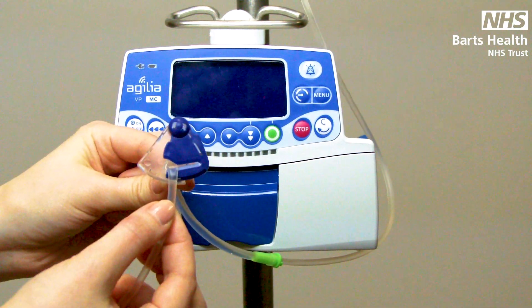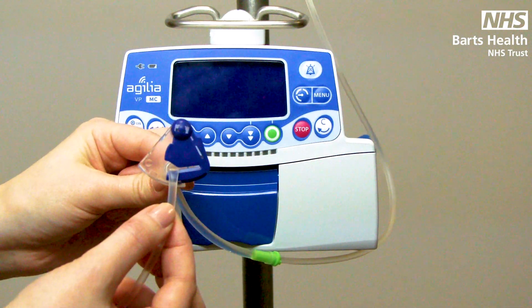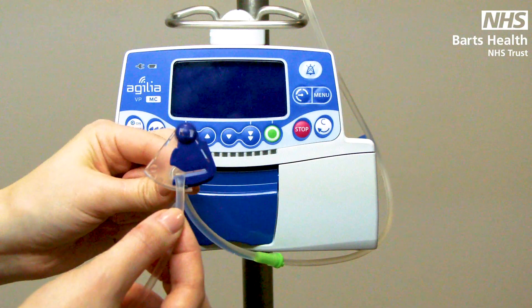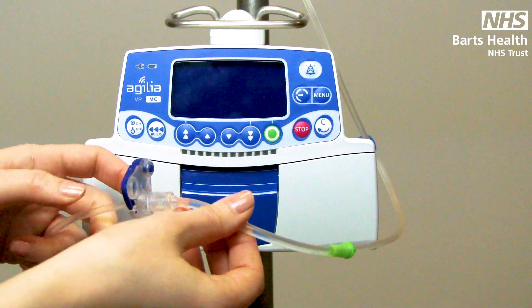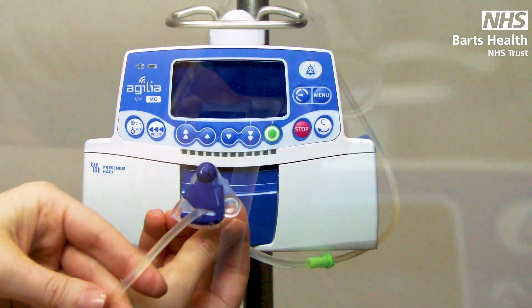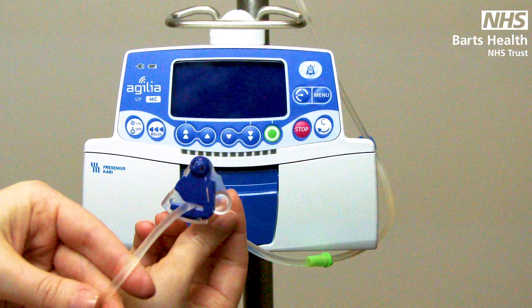The blue section is slightly more than just colour coding — this is your anti-free flow device. It will be open when you get it out of the packaging, to allow you to prime the line. However, as soon as this clamp is popped into the device, the device takes control. And if the door is then opened again, it will be clamped off, meaning you have peace of mind that the fluid or drug will not run into your patient or onto the floor.